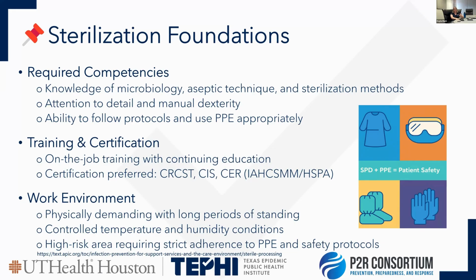As we kind of already saw, there is variation in sterilization practice. If you're using hydrogen peroxide, ethylene oxide, or steam sterilization, the processes and time and temperatures and thresholds are different, along with what biological indicators are used. So you want to make sure that if you have new staff, they are provided with copies of your protocols and procedures, that they know specifically what is going on in your organization. So they know what equipment is used, how to become familiar with it, and to ensure compliance.